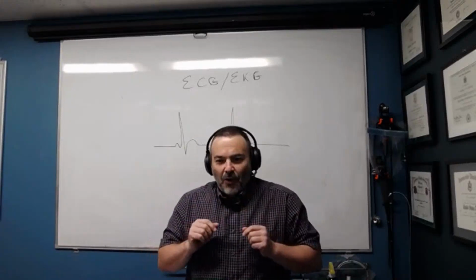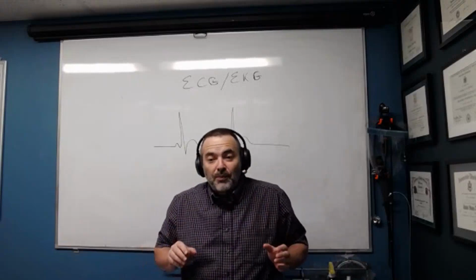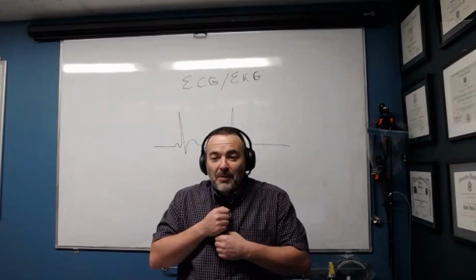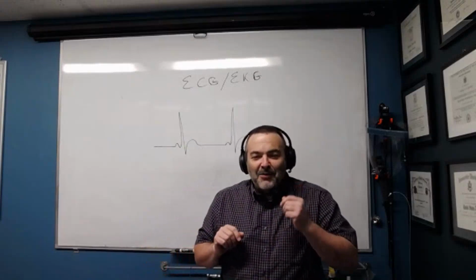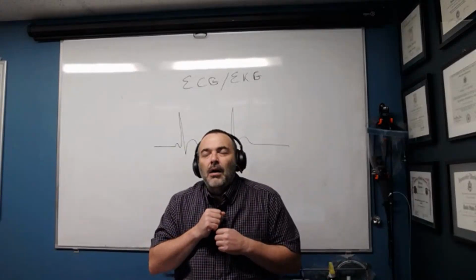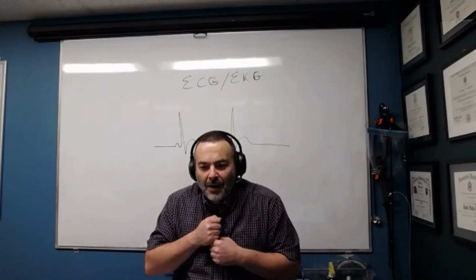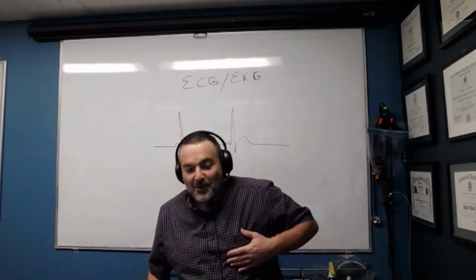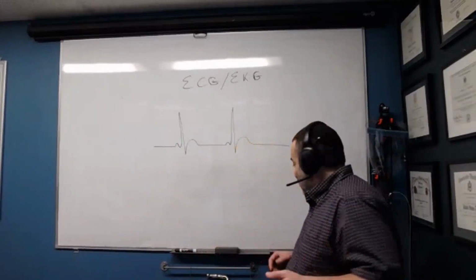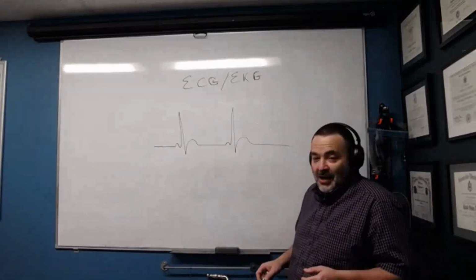It's actually a little bit more involved, but the heart just doesn't beat boom, boom, boom. No, it's ba-boom, ba-boom, ba-boom. Add a few more sounds to it. Ba-boom, ah, ba-boom, ah, ba-boom, ah. You got the ba-booms? People always make fun of me for my ba-booms and the ahs, but let me show you how it looks over here.